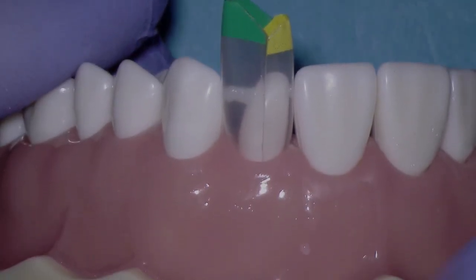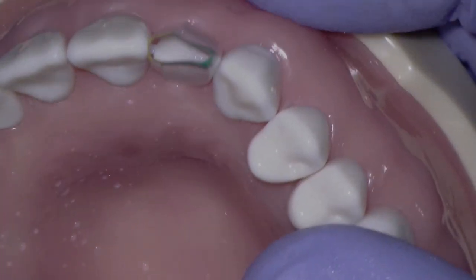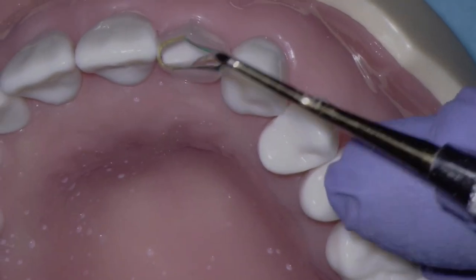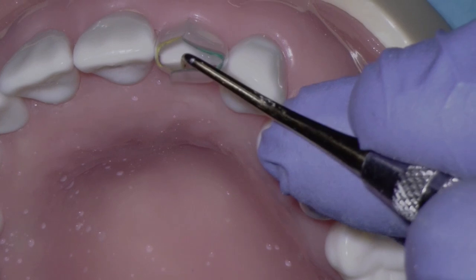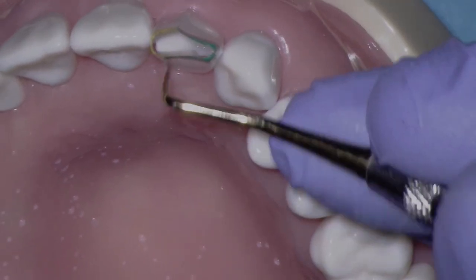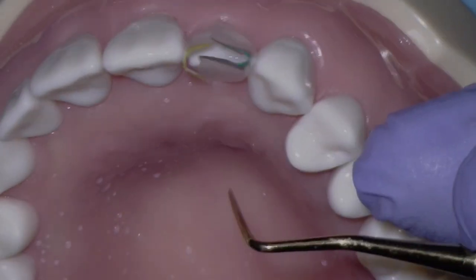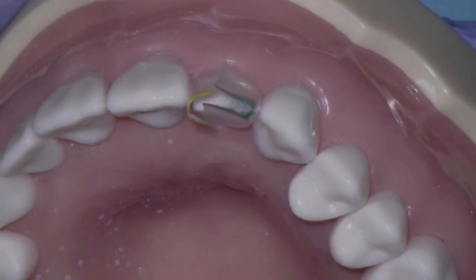There are a couple of things we're going to take a look at right now. Let's take a look at our direct contact strut position. It is centered in the middle of the contact area. It's in the right position both buccolingually, and I like the position occlusogingivally. We're going to check the arrangement of the flaps. This is a good arrangement of the flaps. If I have the yellow on the outside, sometimes that can be less optimal. So let's reverse the flaps just to see the difference. And you can see this is not as optimal as the arrangement that I had a minute ago. So we always check the lingual flaps.